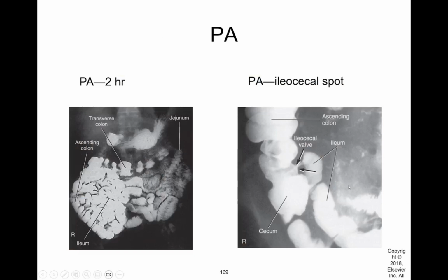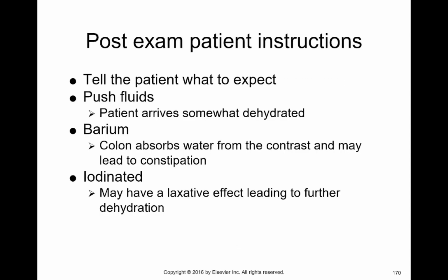So again, ileocecal valve is here, very well delineated there. You just don't see it that well in a lot of cases. I would almost want to believe, because of the lack of contrast in the small intestine, that this is actually reflux filling of the ileum. I don't know that to be true, but that's kind of what it looks like to me.